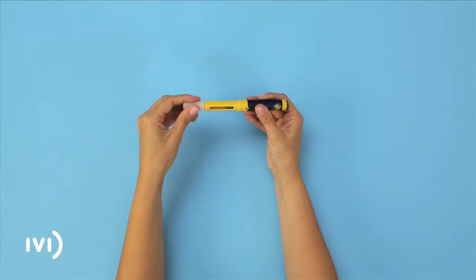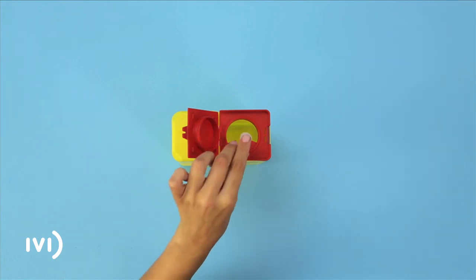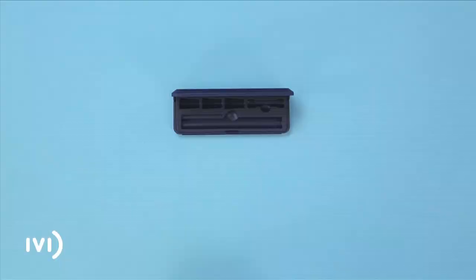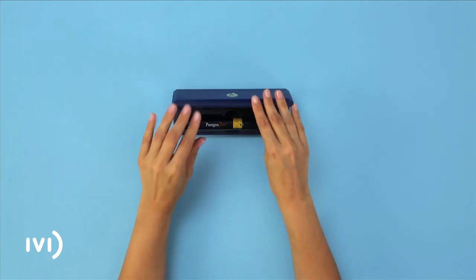Put the external cover back on the needle and unscrew it. Dispose of the syringe in a suitable container or bring it to your nearest IVI clinic. Finally, replace the lid of the pen, put it back in its case and store it in the fridge.